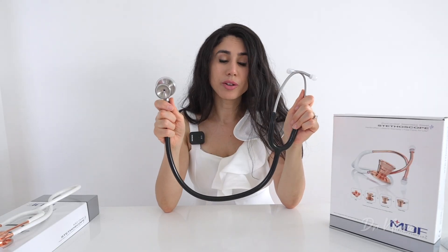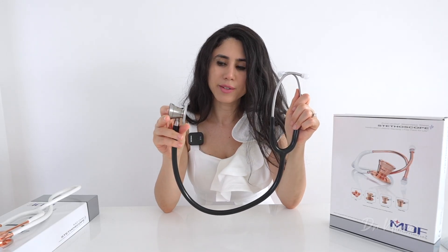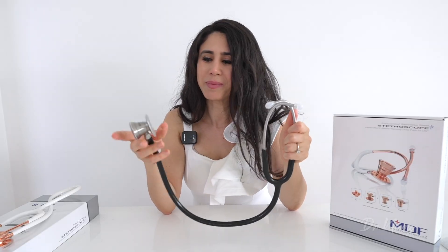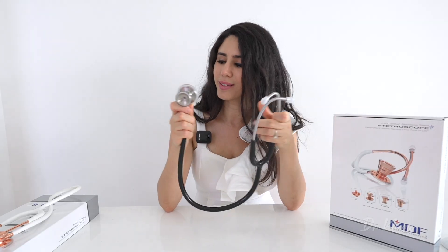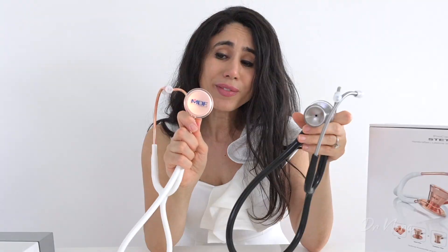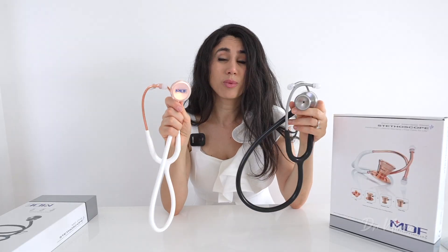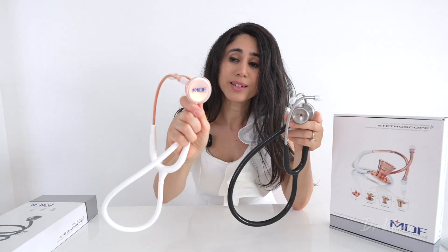So far I'm quite impressed with the MDF Procardial — it looks more heavy duty and reminds me of the Littmann Cardiology Stethoscope that consultants used when I was a medical student. It was always a bit too expensive, so this is a nice budget entry-level cardiology stethoscope. Comparing it to the MD1, it is heavier and feels more durable, though the MD1 was actually quite good for heart sounds and many viewers thought it outperformed the Littmann Classic 3.